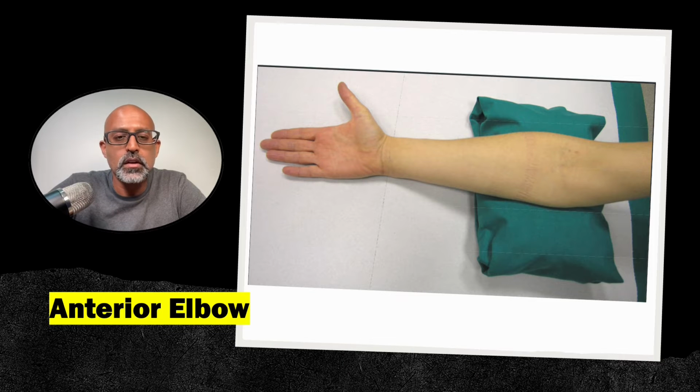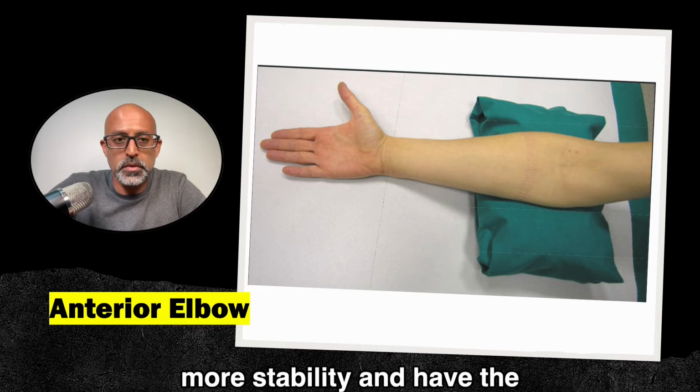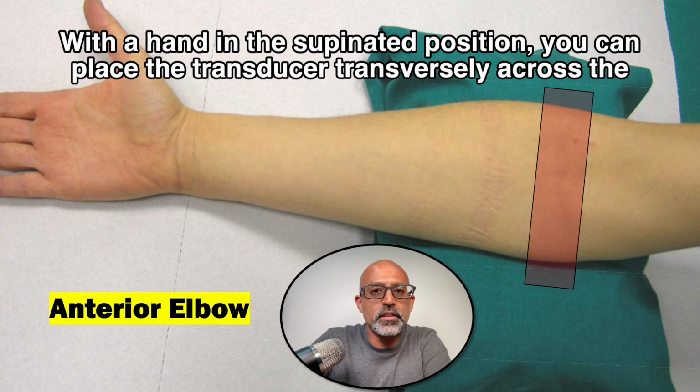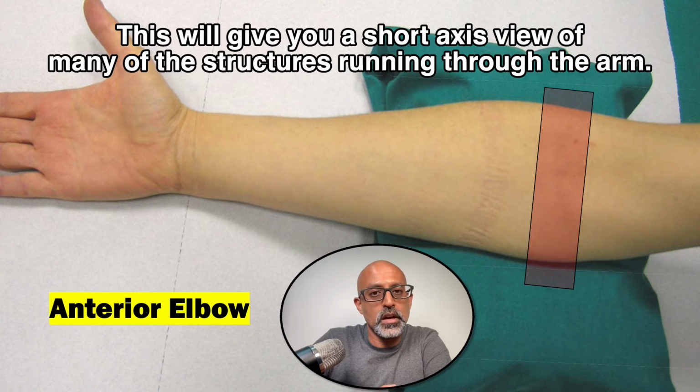elbow. It's useful to have the elbow resting on something like a cushion, just to give a bit more stability, and have the arm in a supinated position to expose the anterior elbow. With the hand in the supinated position, you can place the transducer transversely across the forearm. This will give you a short axis view of many of the structures running through the arm.